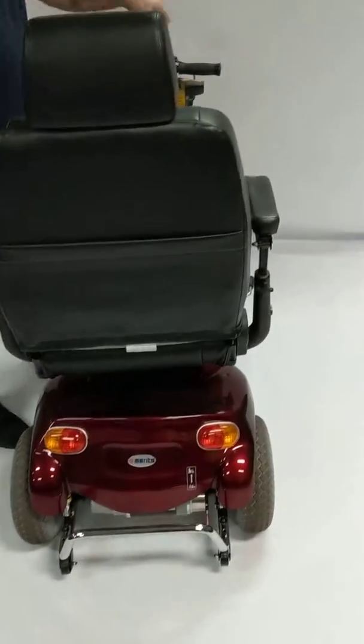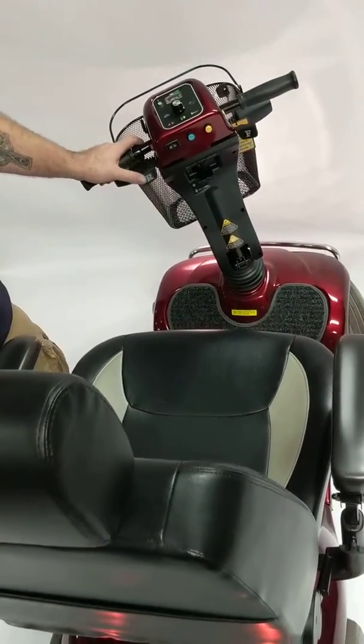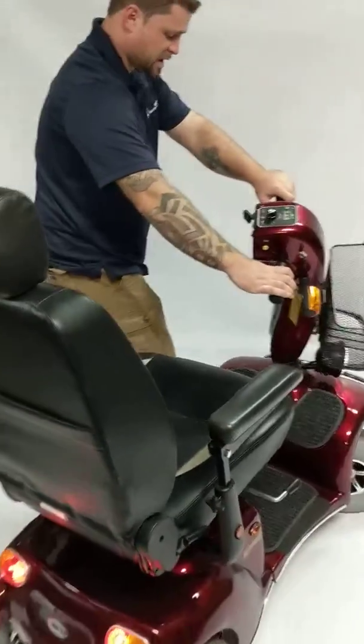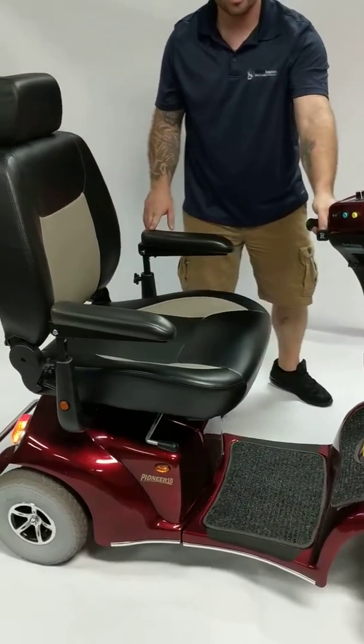Overall, this is a great heavy-duty scooter. It can be used by almost anybody of any size. Like I said, it has a 500-pound weight capacity, six miles per hour, 32 miles per charge.